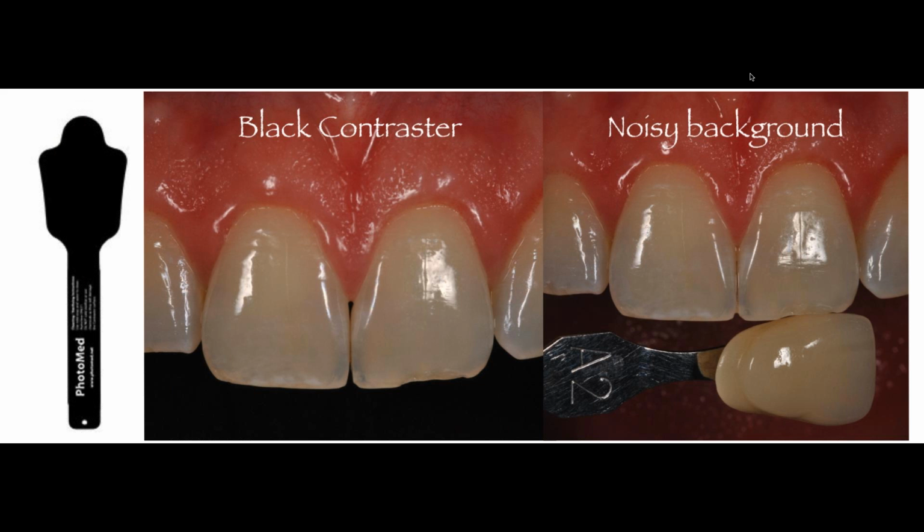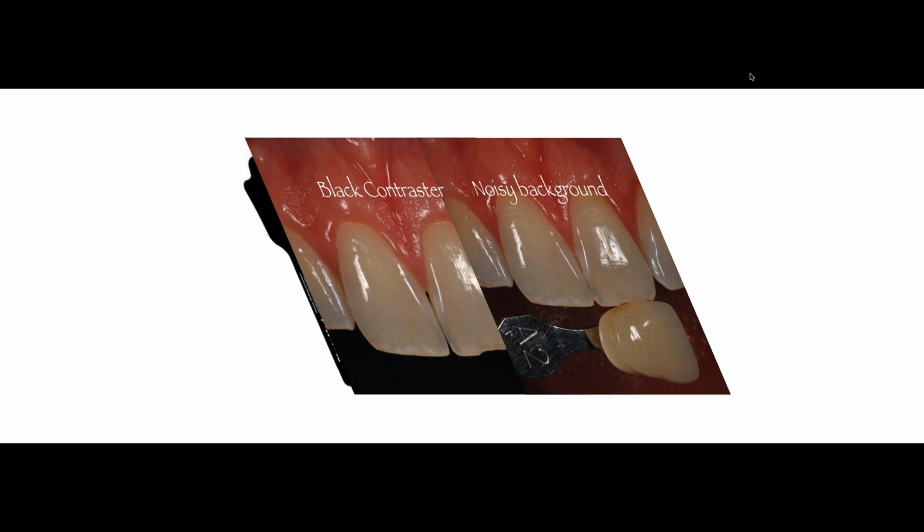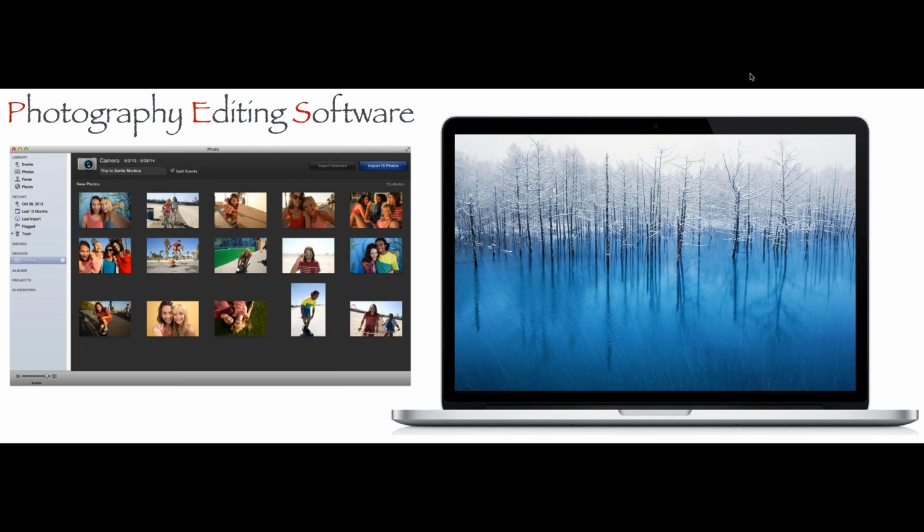This is an actual patient of mine. So you see, this is what the contrast does for you. It sets your eyes on the important aspect of your photo. It just eliminates the noise of the background.